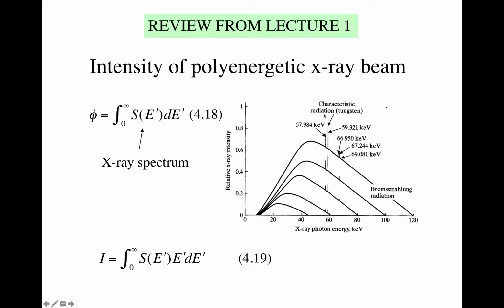So it has a central peak, and when you're modeling X-ray imaging, oftentimes if you want to model a monoenergetic X-ray source, you would just take the mean of this peak, right? To say, okay, I can't really track X-rays at all of these energies, say for 100 kV. I'm just going to take the mean, which is here, which is like 50. And I'll do all my calculations there. Not a great assumption, actually, but reasonable for many purposes.